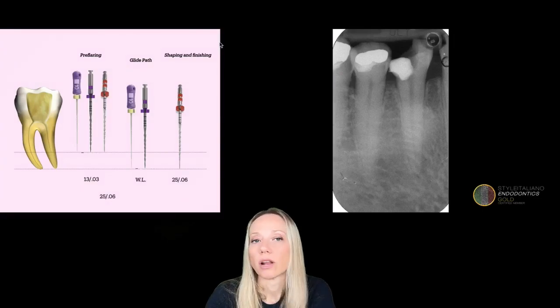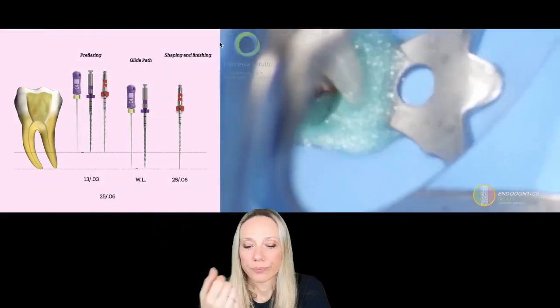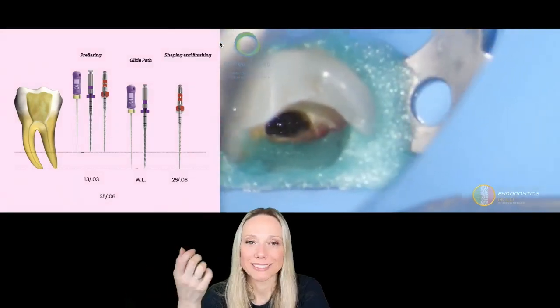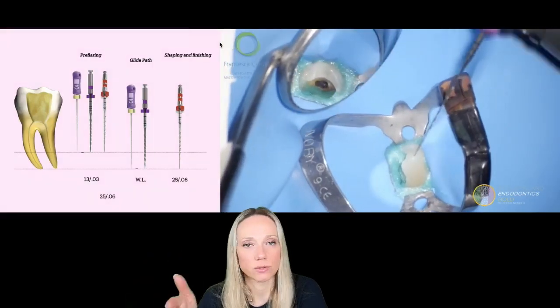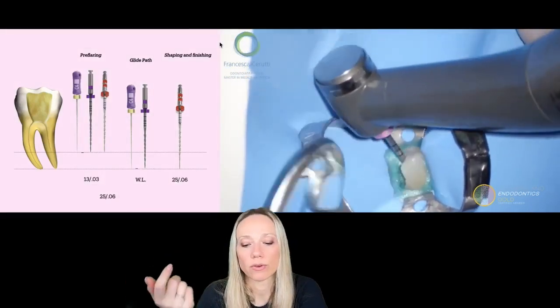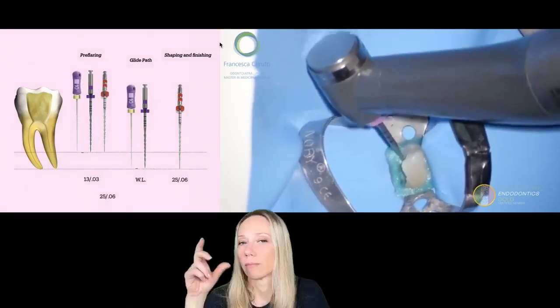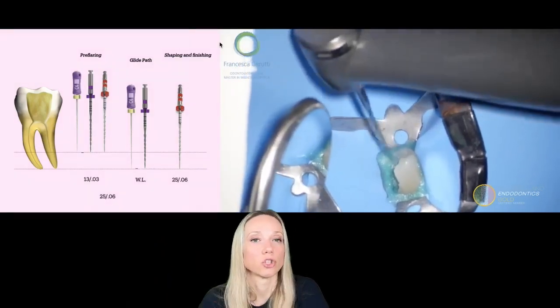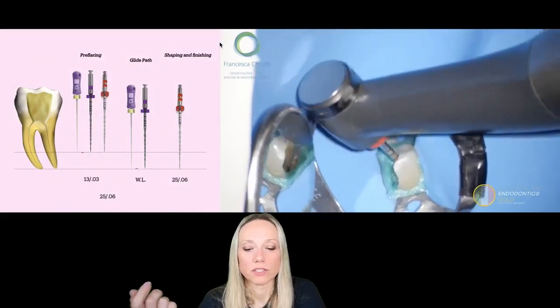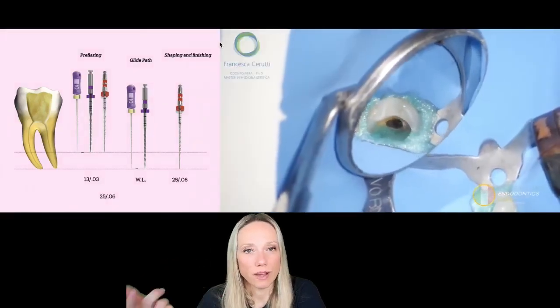In normal cases, in regular cases, so those canals that are straight or slightly curved, I can do one thing. I can just skip one file in the sequence. Because when I see that my 1303 goes, I just use some coronal pre-flaring because maybe before the curve I want to play it safe, so I drive my 10K file, my 1303 short to the working length, and then I skip directly to the 2506 and I see if it's working or not, because the room that I have allows me just to skip a file in the sequence.